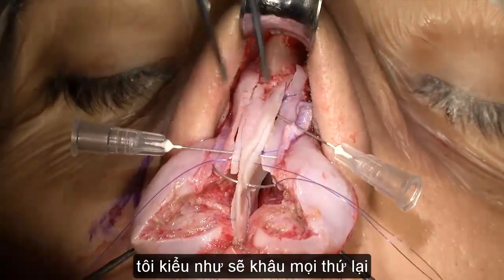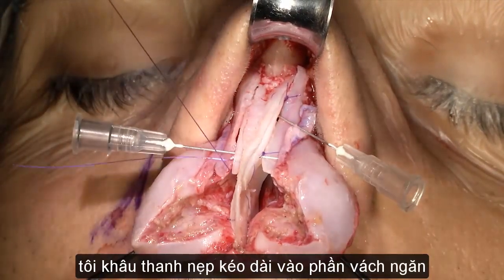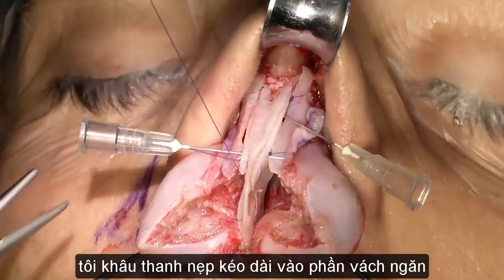Alright, so I'm kind of joining everything now. Okay, so I'm joining this spreader to the plate.